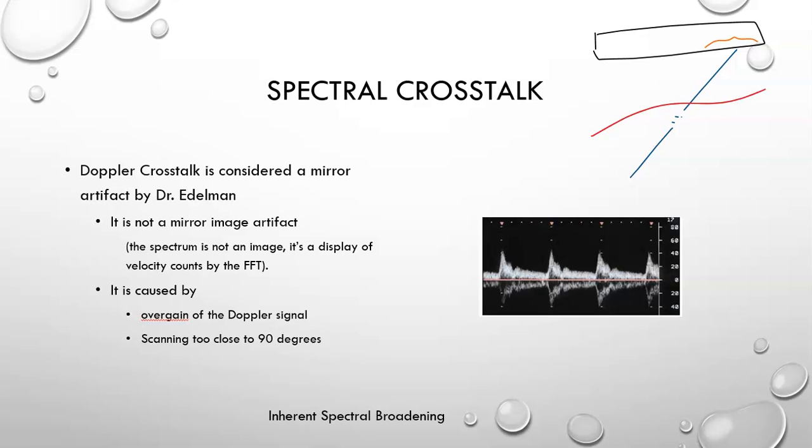So let's just put an artery in there so that we've got something to interrogate. The artery is not important in this discussion, but the distance from this microcrystal here to the angle to this microcrystal and the angle to this microcrystal are slightly different. Okay, so these two angles are slightly different.